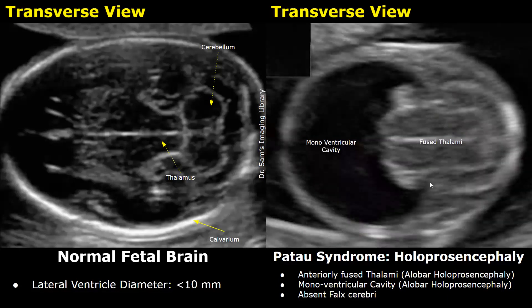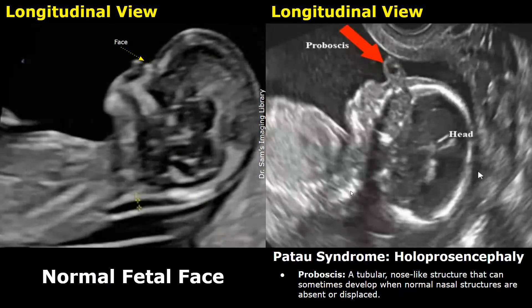The fused thalami are seen on the anterior side of the brain, and the monoventricular cavity is usually seen posteriorly. These features strongly suggest alobar holoprosencephaly. The falx cerebri is also absent.